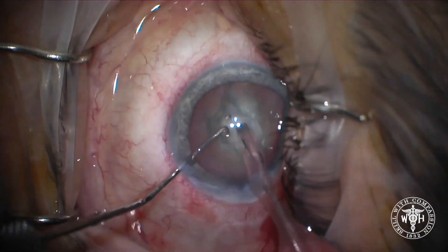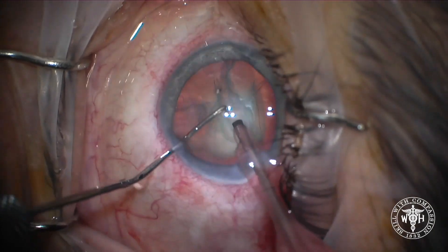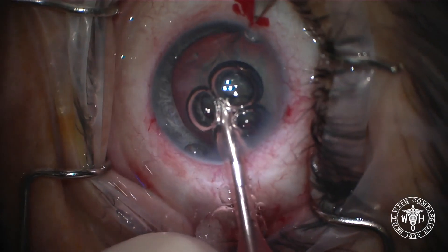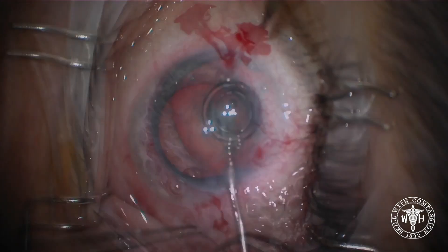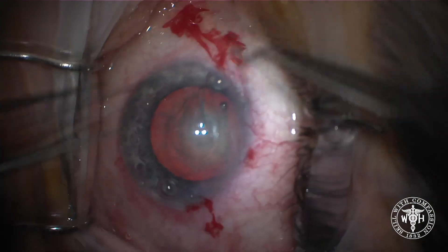The case has already started and I'm moving it in fast forward so you can see that dilation of the pupil. You can see the deepening of the chamber, the posterior movement of the lens, and that patient is groaning every time that happens in pain.